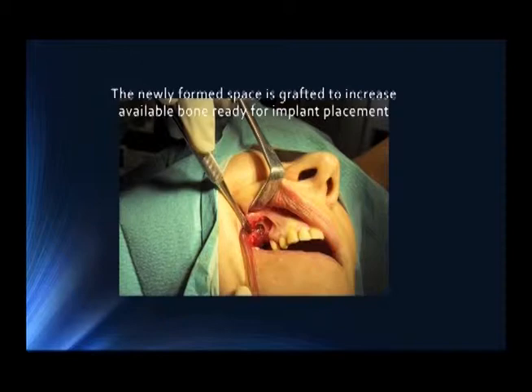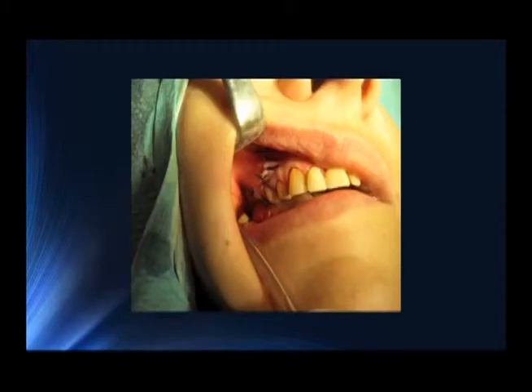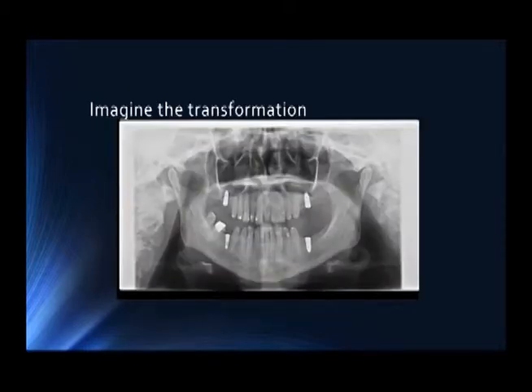And you're going to be able to see over time that it will create a wonderful spot for the implant to be placed in, with some bone grafting material, as well as lifting the sinus up out of the way. So it's really great for you to be able to see the end results once that's all sutured up, and that could create a wonderful transformation. As you see, this client ended up with quite a few implants, but some sinus lifting procedures so that they could have room to place those implants.